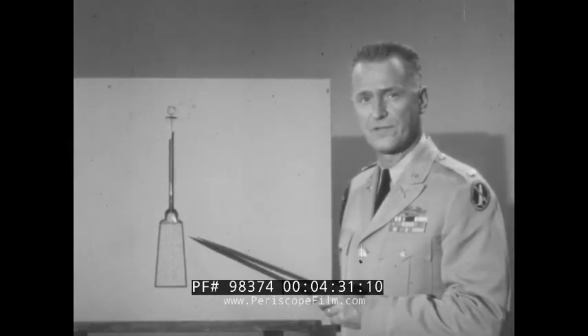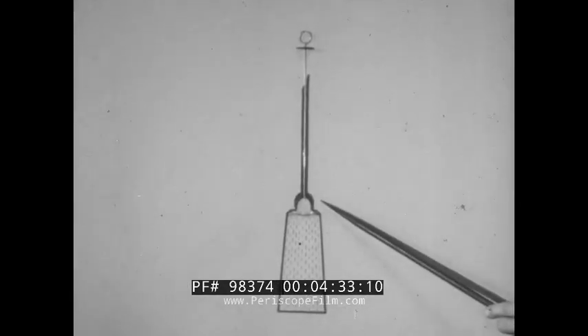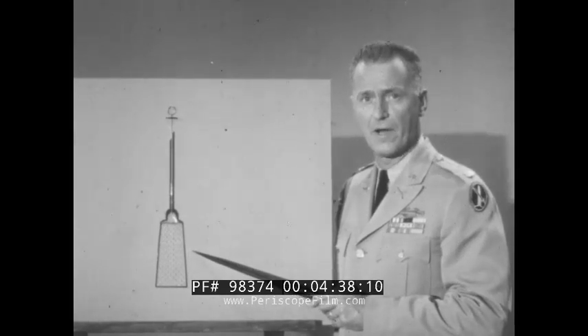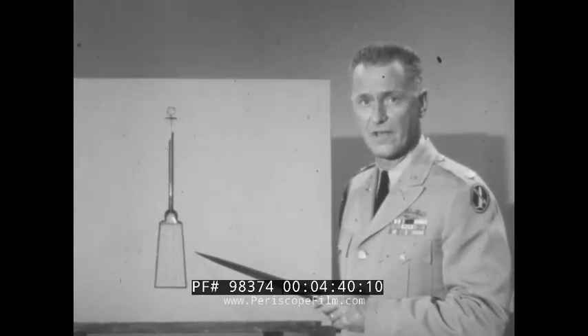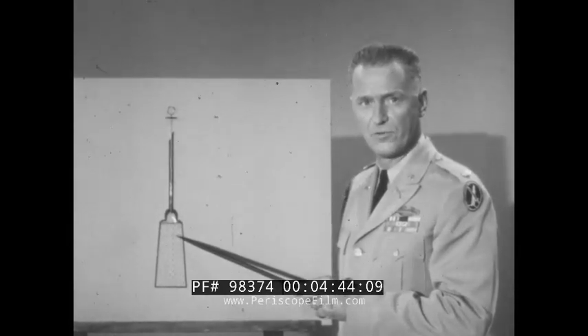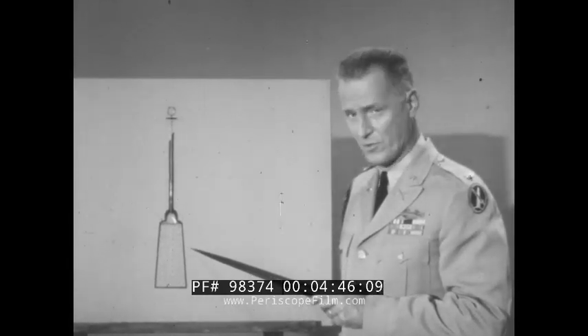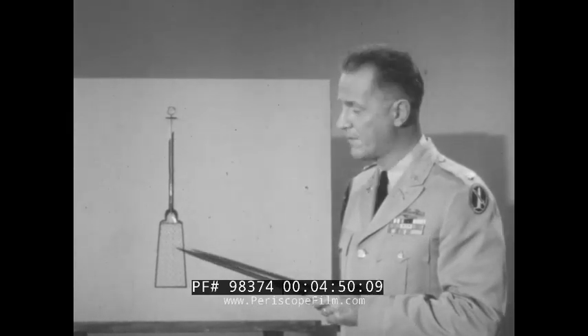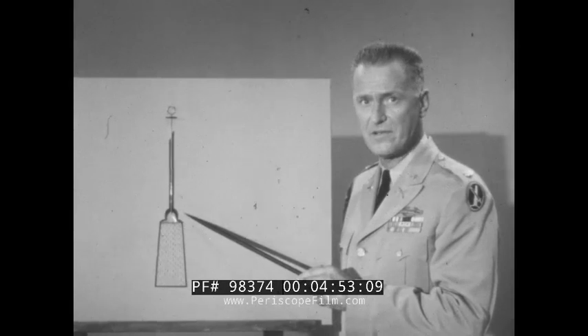First, be sure you hold the syrette by the hub here, not by the soft body of the tube. If you hold the syrette by the tube, the liquid contents may accidentally squirt out when the seal is broken. So do not hold the syrette by the tube when you are breaking the seal. Remember, hold the syrette by the hub here.